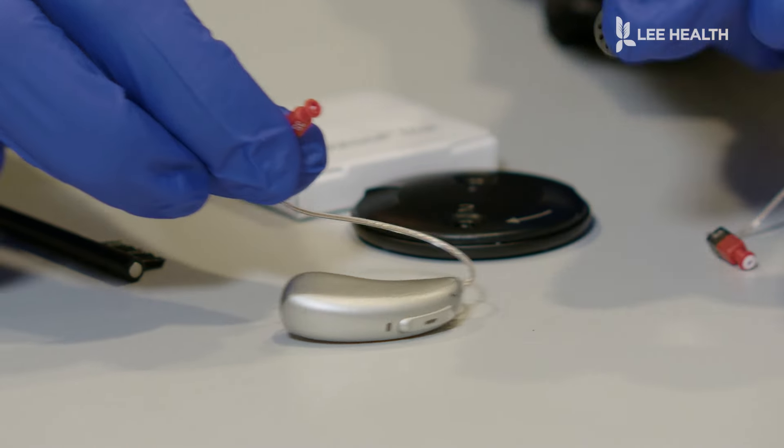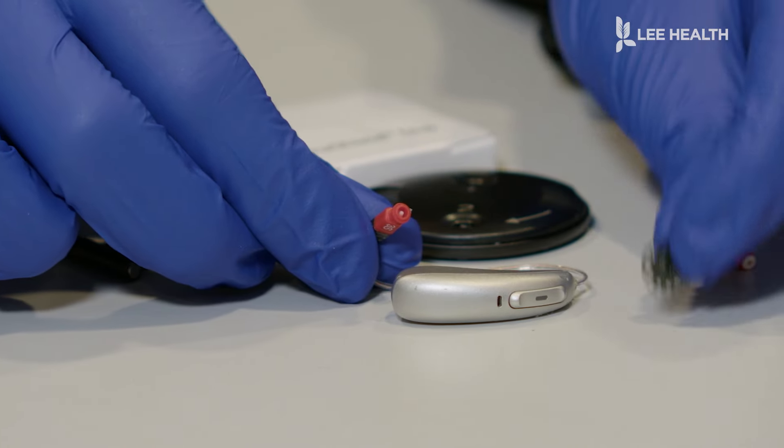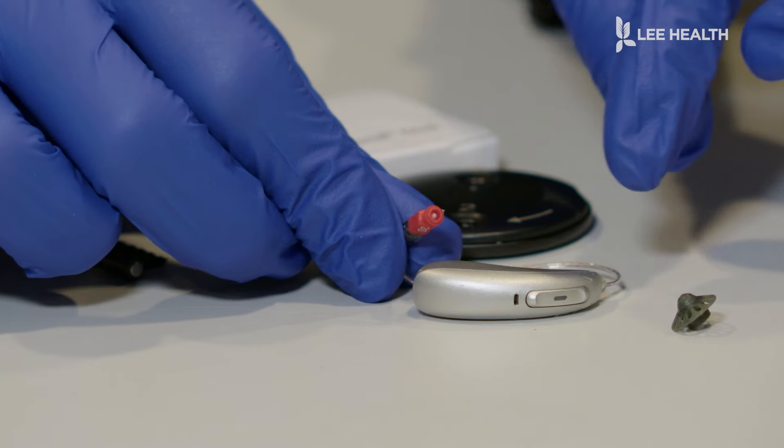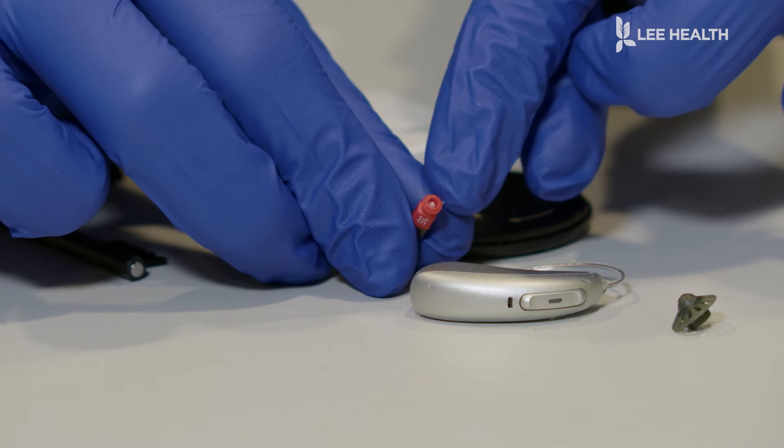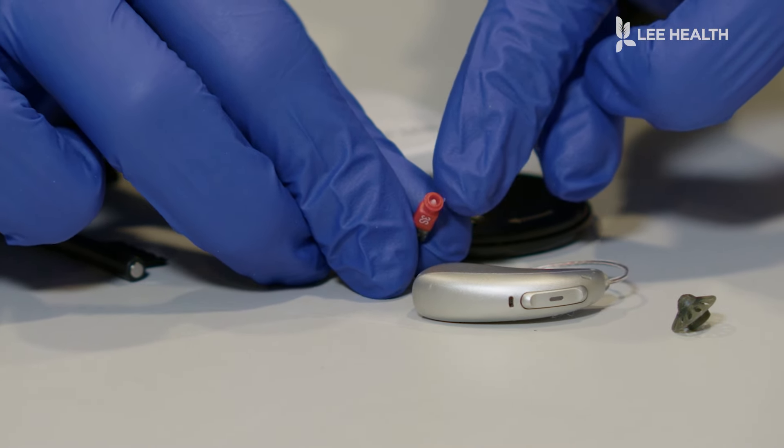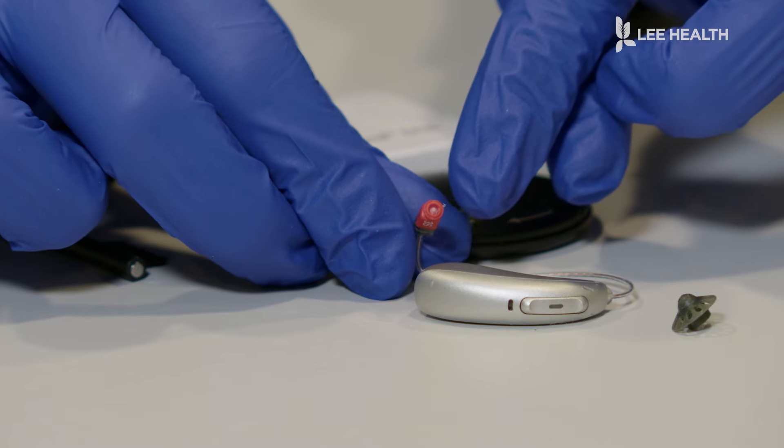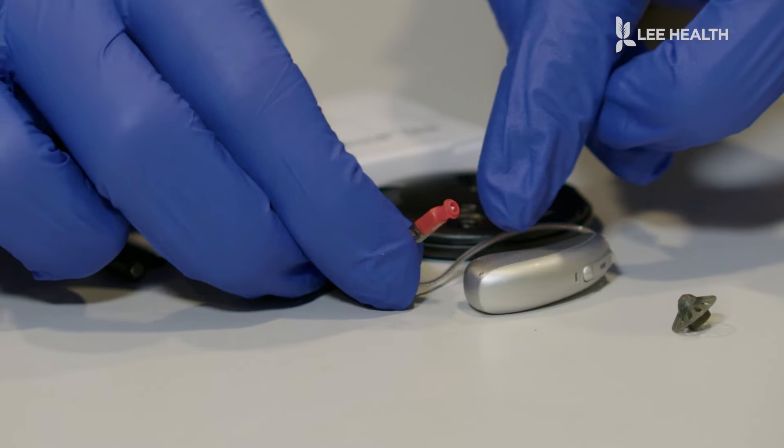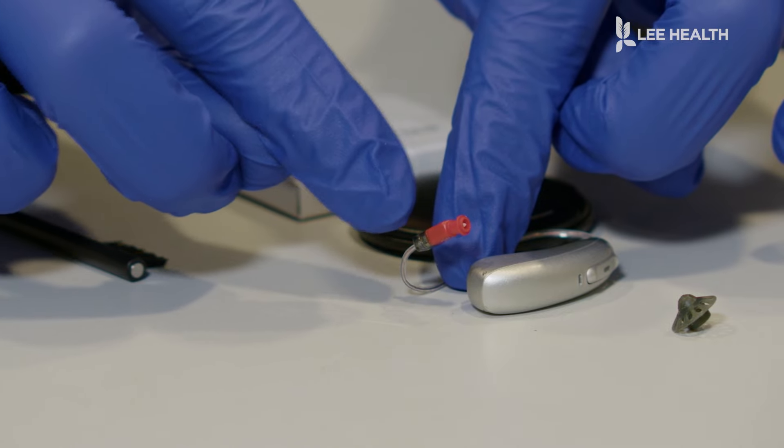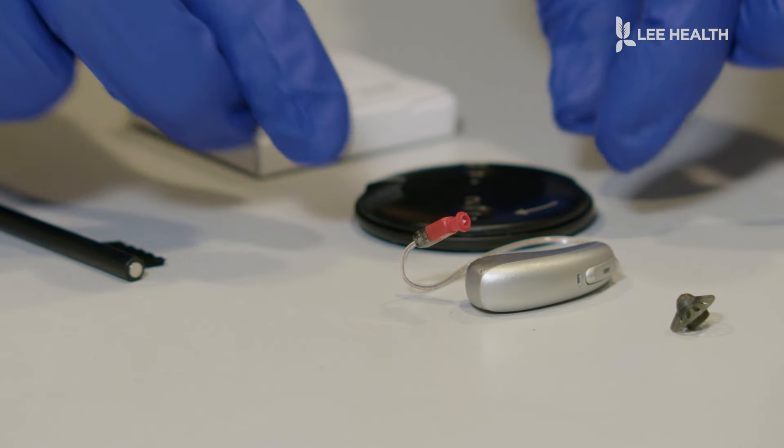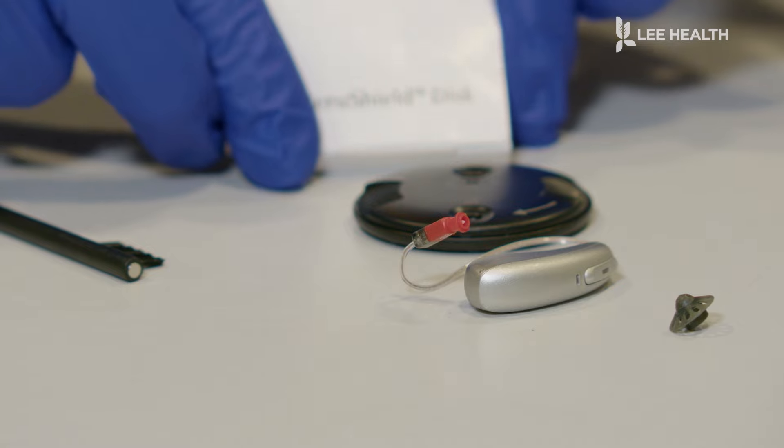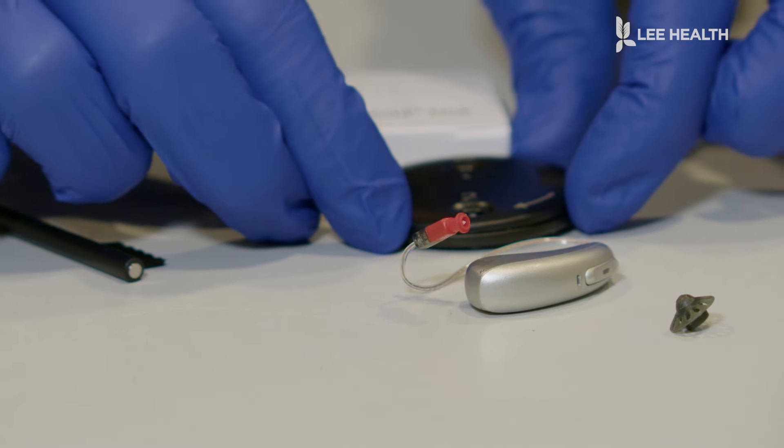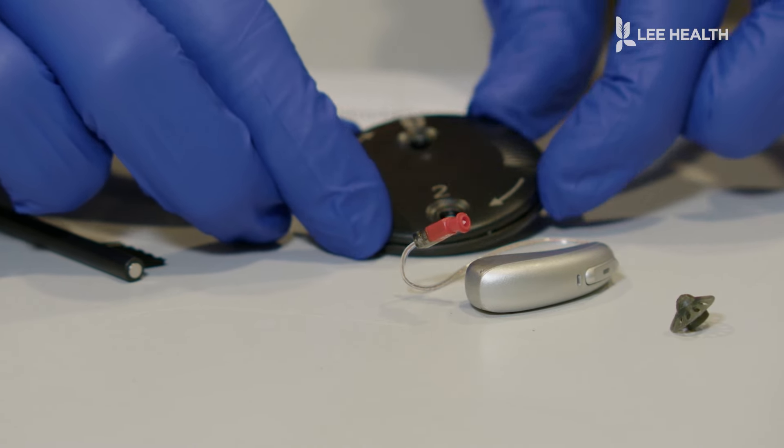So once that dome rubber tip piece is disconnected, you can put it to the side, and now we're focusing on the inside piece. This is called a wax trap or a wax guard, and it's designed to catch any wax or debris before it goes into the electronic computer component of the hearing aid. So you're going to take your Seroshield disc. If your wax trap system looks like this circle, this is what we're going to be using.